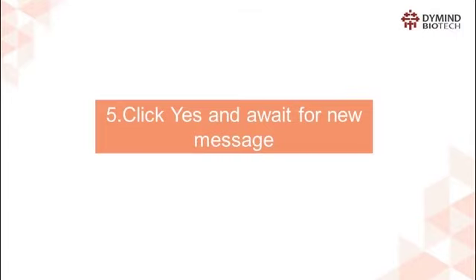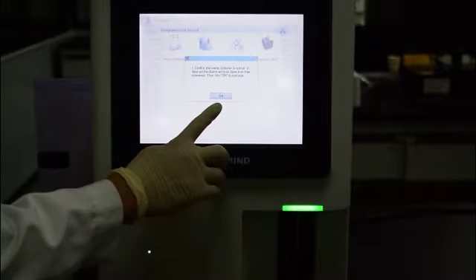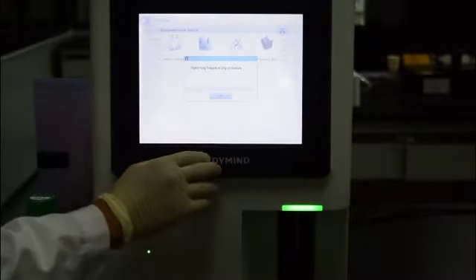Step 5: Click Yes and wait for the new message. It will remind the operator to put the diluent and lyse pipes into containers filled with distilled water.